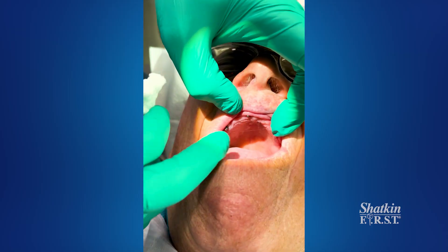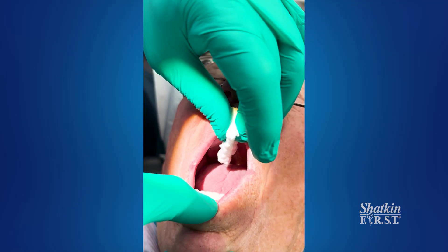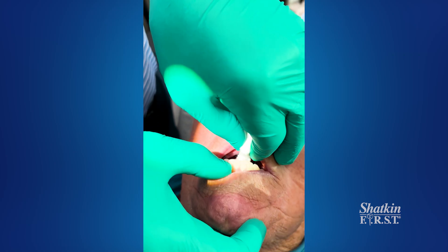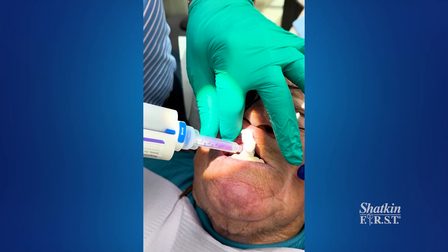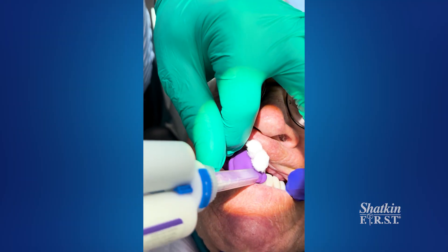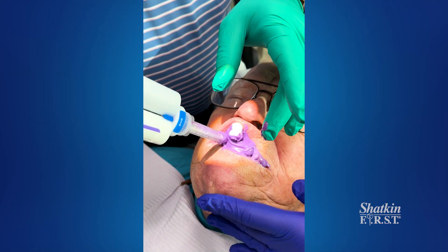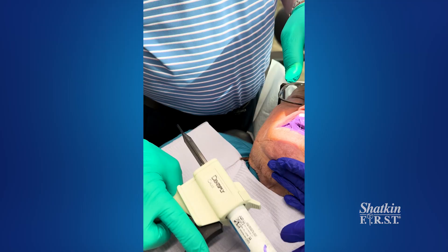Close gently, sir. Close right there and hold it right there for me. Okay, hold it — he's moving a little open. Let's try again. Close together and hold it right there. Don't move — hold his chin still, please. Hold it together just like that. You can use any registration material you want. This happens to be Regisil 2x — just hold it right there, don't move.